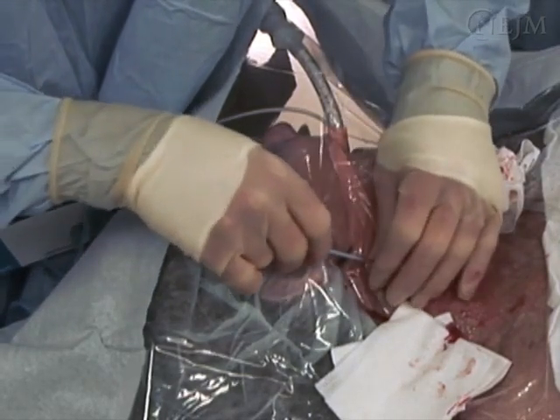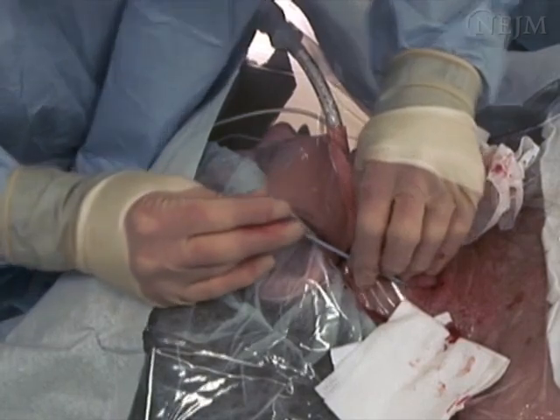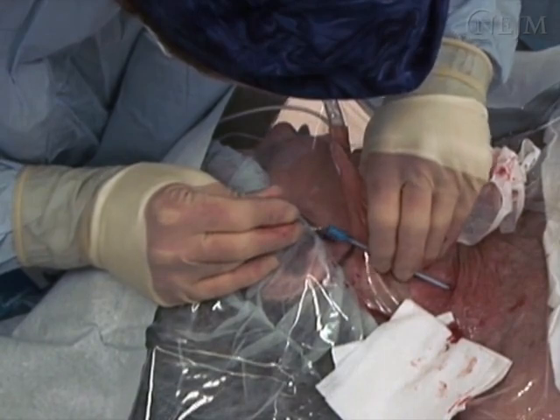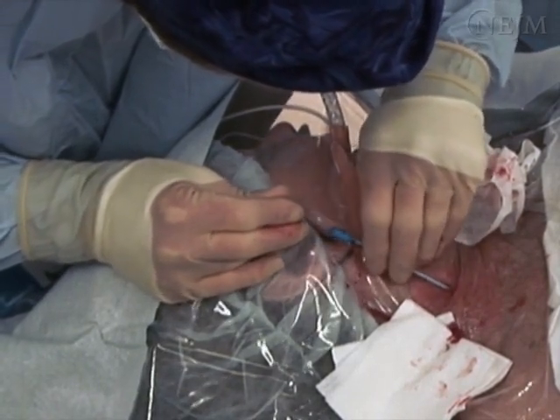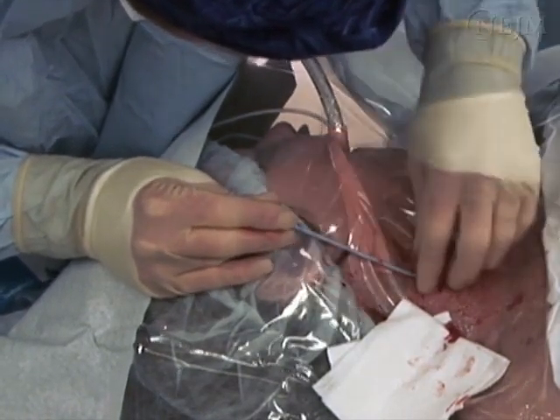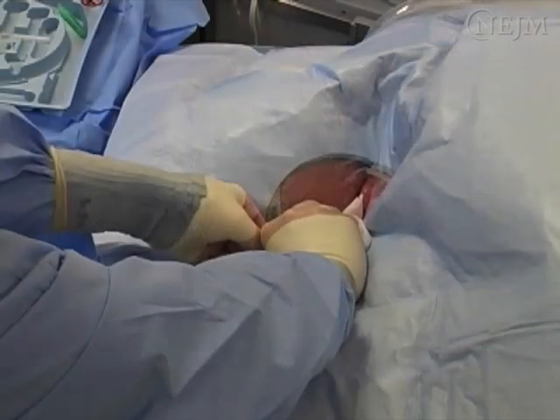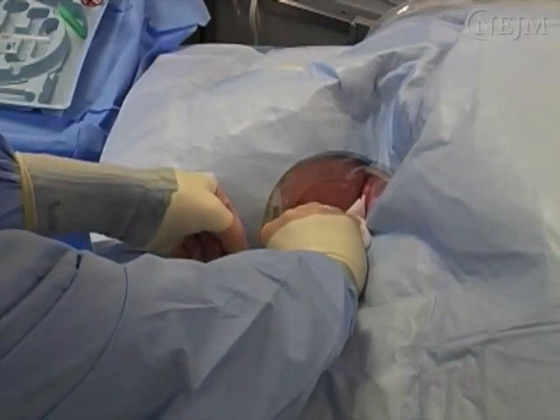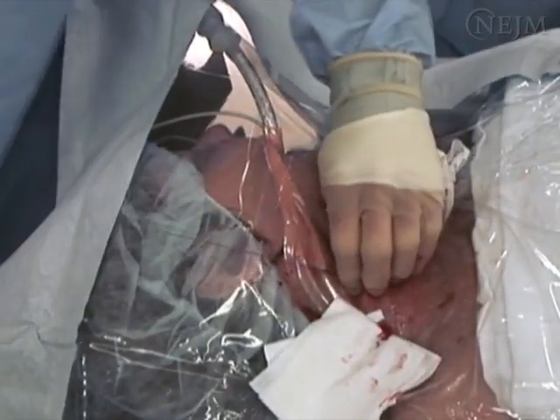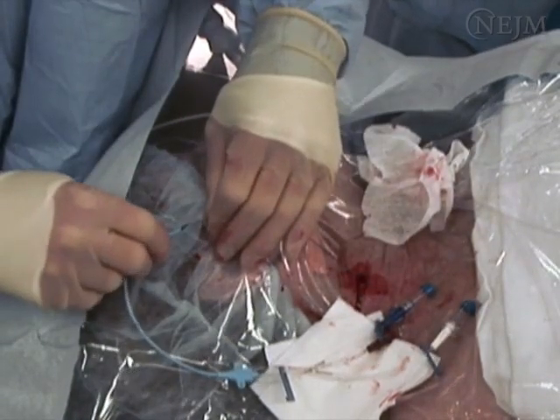Be careful not to cut the wire. Place the dilator over the guide wire, being certain to maintain control of the wire at all times in order to prevent a wire embolism, and advance the dilator 1 to 2 centimeters by holding it close to the tip and rotating it. Be careful not to introduce a bend or kink in the guide wire. Remove the dilator, anticipating increased bleeding. Maintain a grasp on the wire. A 4x4 gauze pad can be applied to the insertion site to minimize blood loss. Once again, only the wire remains in place.